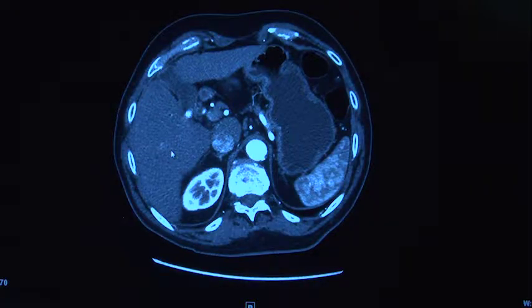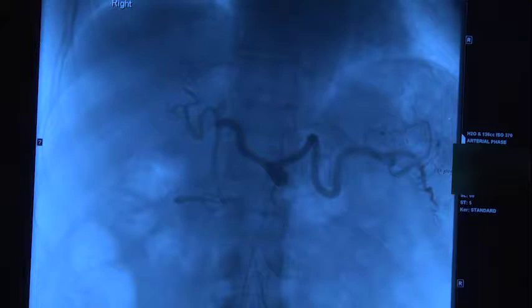And it was decided that the best therapy would be a chemoembolization, which is the infusion of chemotherapy to the lesions with the intent to kill tumor. So following the conference, we brought the patient to angiography, and this is a representative image.